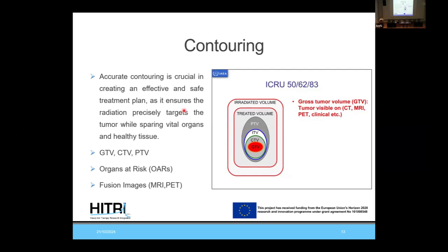It can be fused very well, but it's a better method, if you want to be more precise, to use a table like radiotherapy. I think in Theagenio, the PET also has a board, a table similar to the linear accelerator, and the CT simulator.